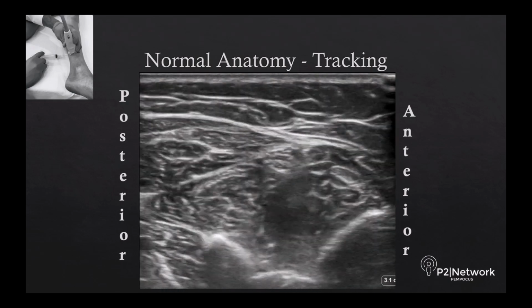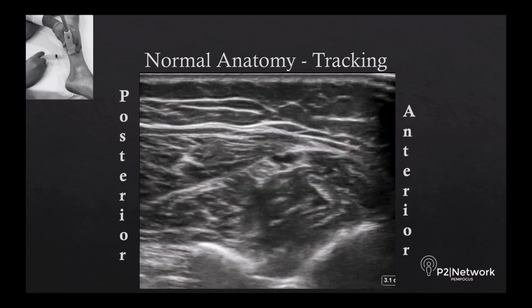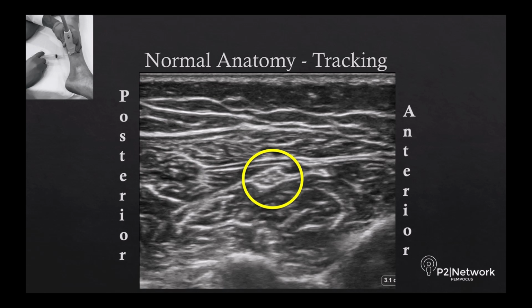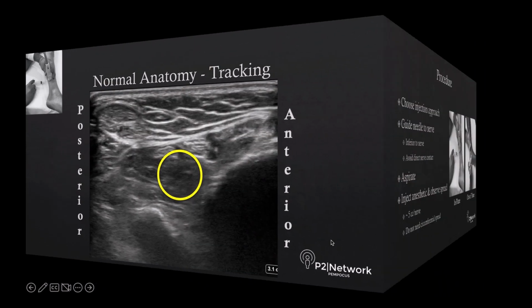You'll see the bony landmarks begin to fall away and more muscle of the soleus coming in from screen left, until we get to the level here, where we're now sitting just above the Achilles tendon with that nerve sitting nicely within a bed of muscle. You can easily imagine bringing your needle in with a nice perpendicular line to come in just beneath that nerve.